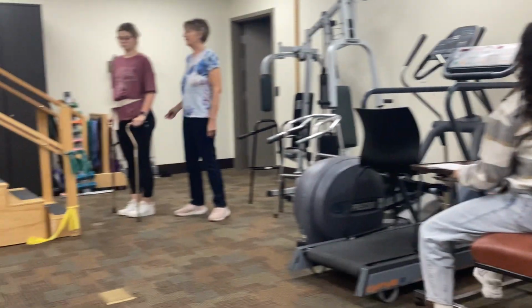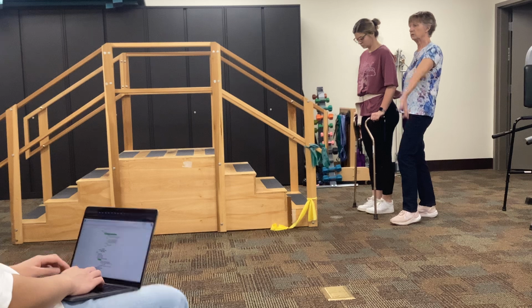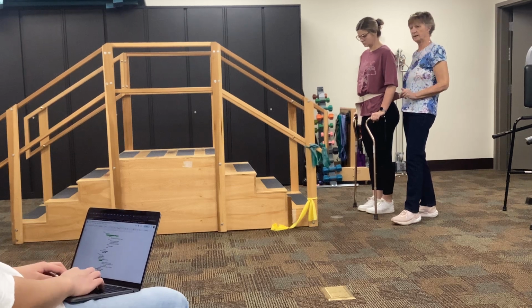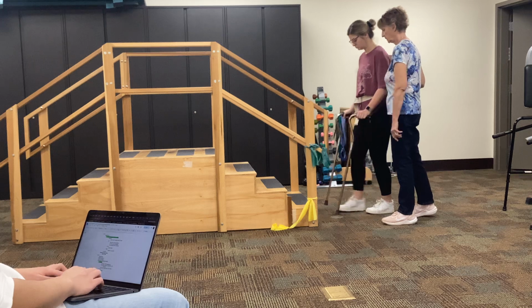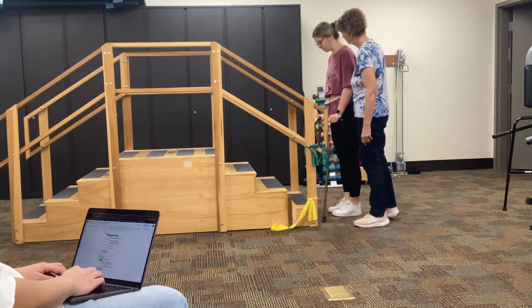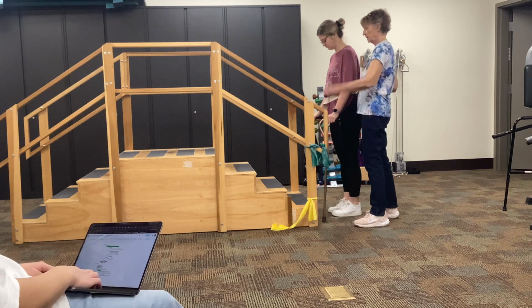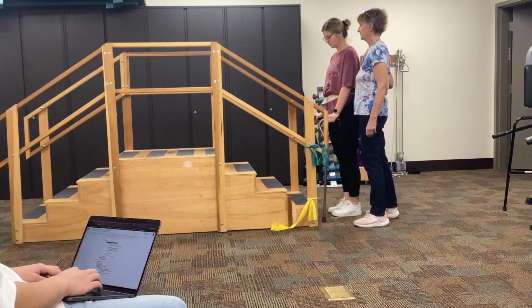So, the safest option is typically to revert to the 3-point gait on the stairs. So in other words, come on up here, and which is your stronger side? Right. Okay, and what's our stair mantra? Up with the good, down with the bad. And where will the cane stay?